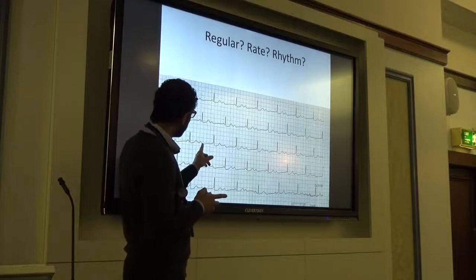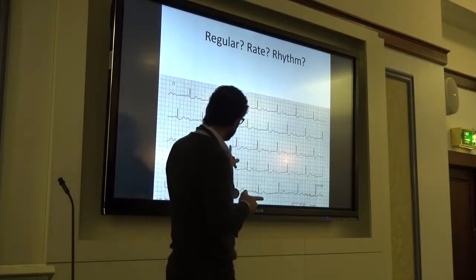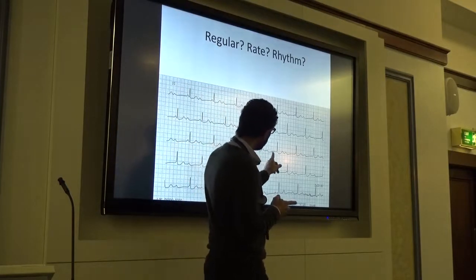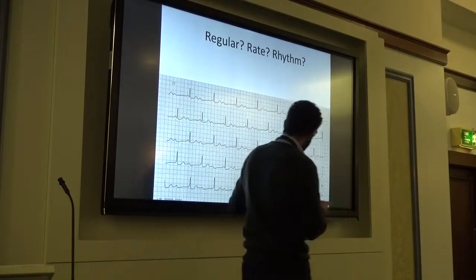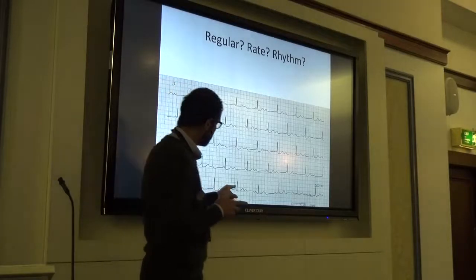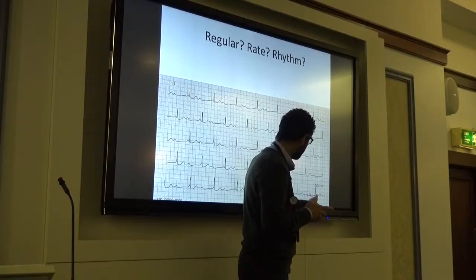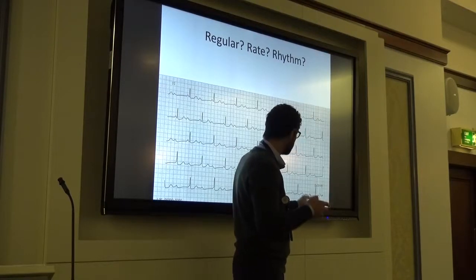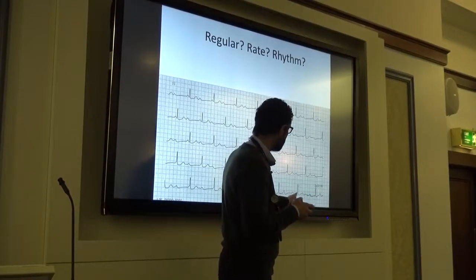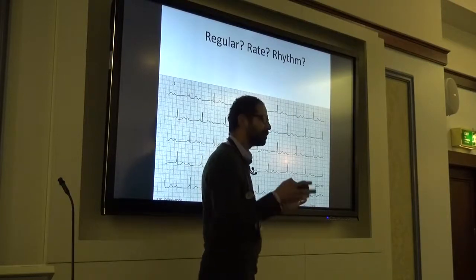Yeah? So I can see a P wave here, and maybe a QRS. P wave, and then a bizarre complex, and then QRS. P wave, QRS, P wave, QRS. But the P wave is not keeping a constant relationship with the QRSs. Look at this one here, for example. You get P wave, QRS. So you could say maybe 2 to 1, right? A P, QRS. You get here just one P wave, QRS. Here you get a P wave that's not maintaining the relationship.